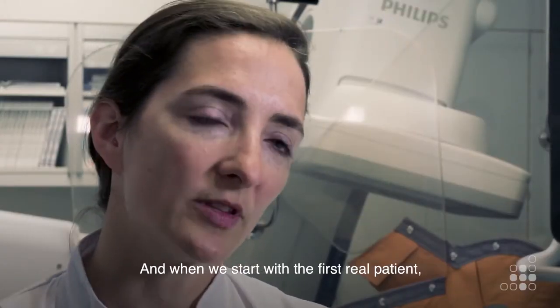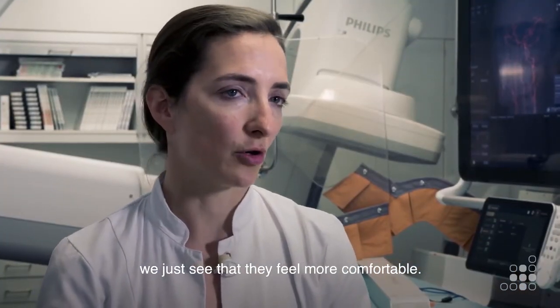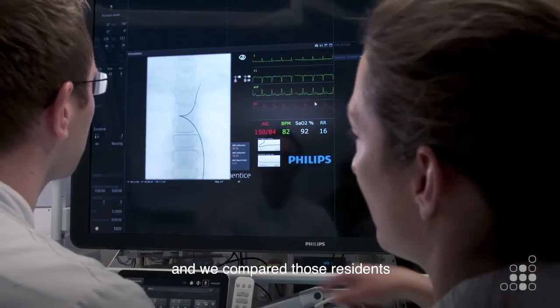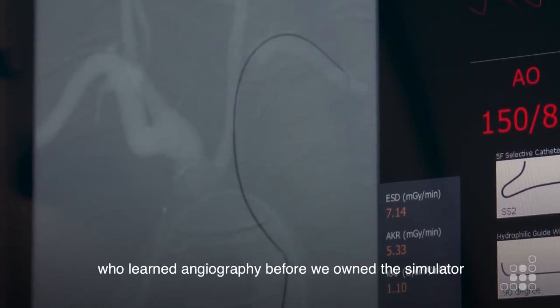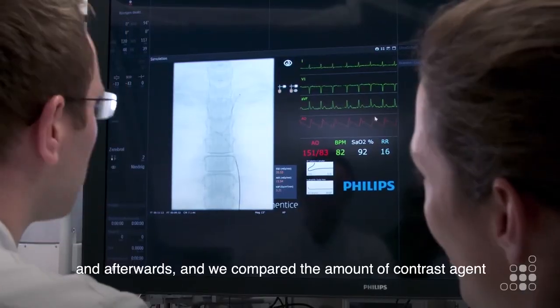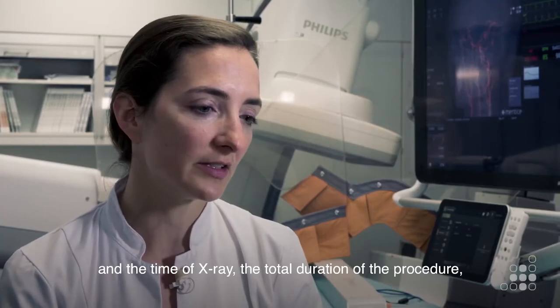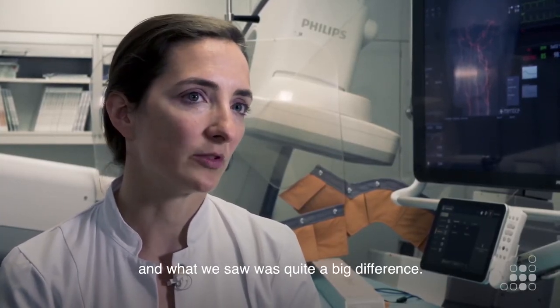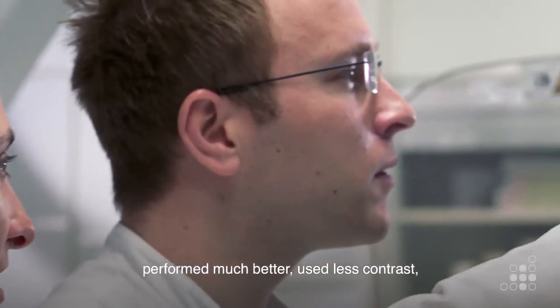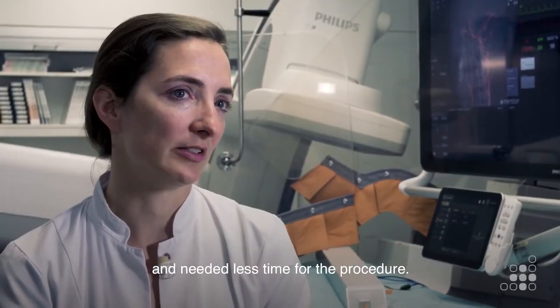And when we start with the first real patient, we just see that they feel more comfortable. That's what we see every day, but we have also done a study about it, comparing residents who learned angiography before we owned this simulator and afterwards. We compared the amount of contrast agent, the X-ray time, and the total duration of the procedure, and we saw quite a big difference. The residents who trained on the simulator performed much better, used less contrast, and needed less time for the procedure.